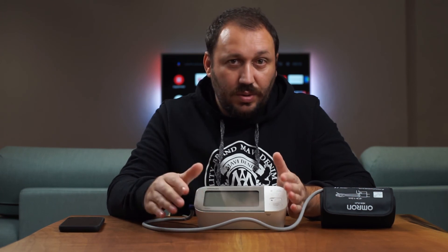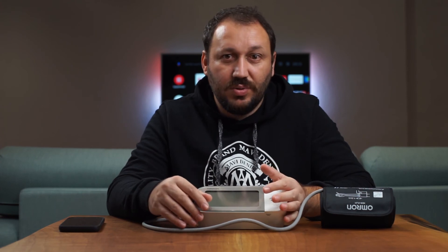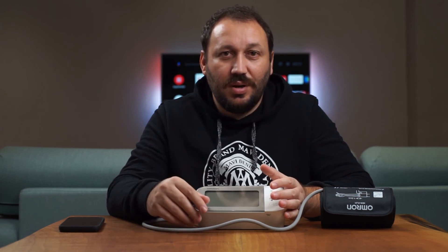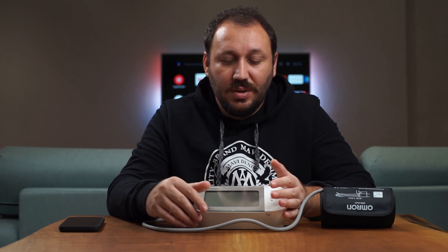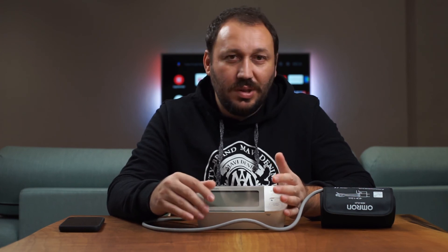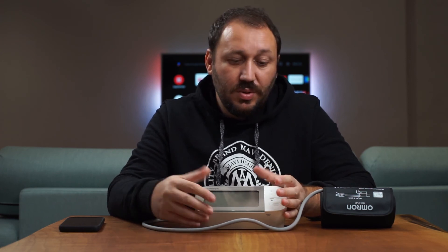Honestly, I can freely recommend any Omron device. Some other brands gave us trouble — my dad monitors his blood pressure a lot and we had issues with other brands. Since getting the Omron we've had no trouble at all. It could be a little expensive so check your budget, but it's a really good brand.